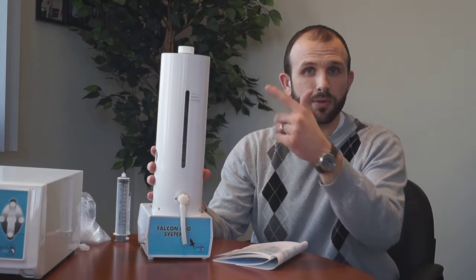Then we have ozonated water and saline. The Falcon H2O system is an easy way to ozonate water or saline — you can fill it from the top and connect it through an ozone-resistant line to your ozone generator. By doing that, you can bubble ozone through the water or saline and then use that subcutaneously, to lavage, or for a number of different applications.